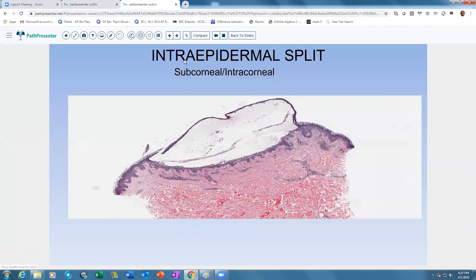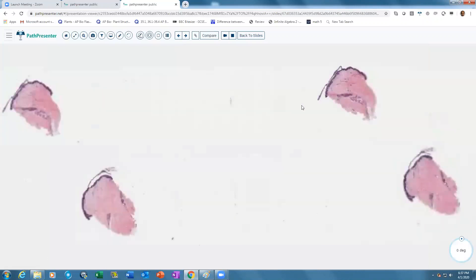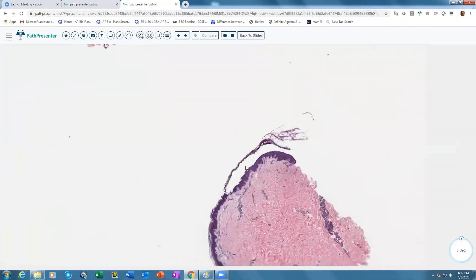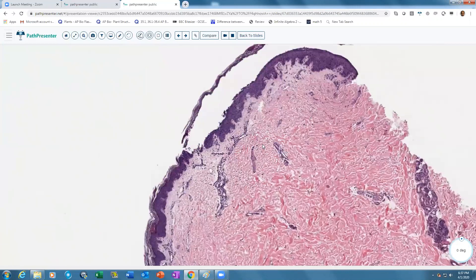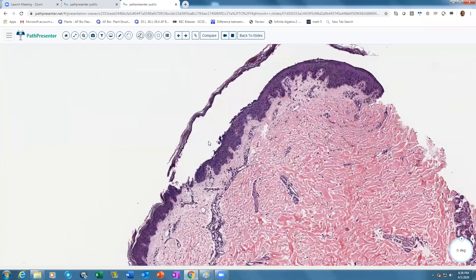The first example is an intraepidermal split at the subcorneal level — just below the stratum corneum. A two-year-old boy presents with fever and diffuse red superficial peeling with perioral furrows. Looking at the slide, the split is at the level of the stratum corneum, confirming an intraepidermal subcorneal split, which narrows the differential considerably.